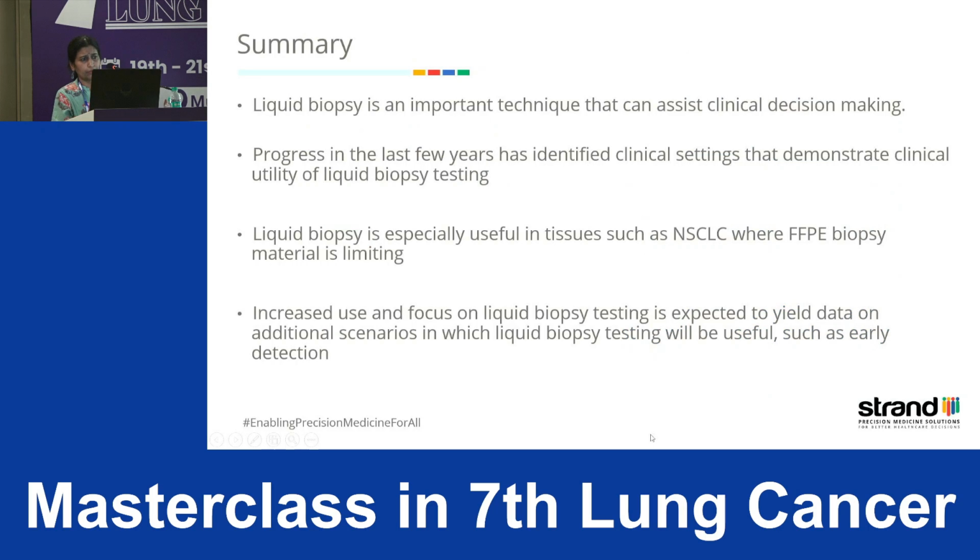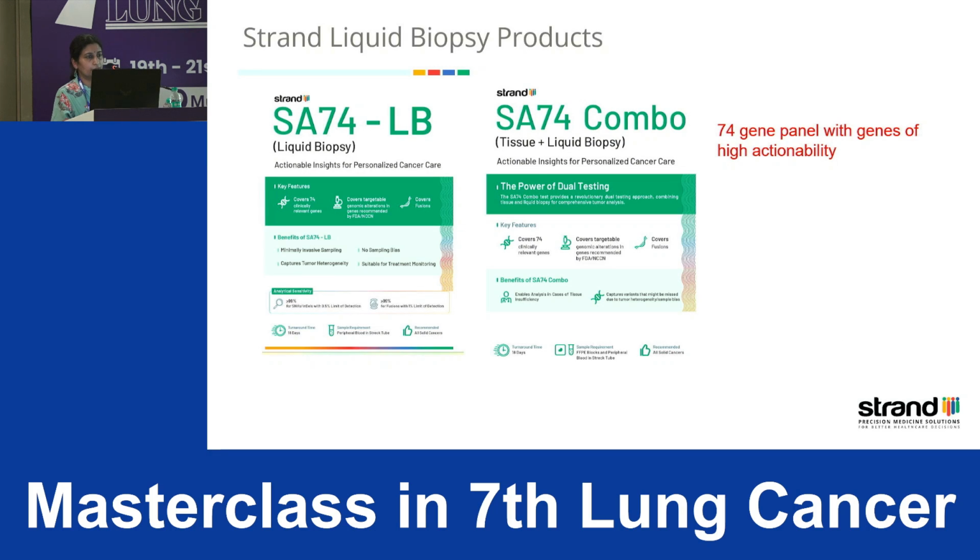So to summarize, liquid biopsy is an important technique that can aid in clinical decision making. Progress in the last few years has identified clinical settings that demonstrate clinical utility, and much work is of course needed. It's especially useful in tissues like NSCLC where FFPE biopsy material is limiting. Increased use and focus on liquid biopsy testing will yield additional data on additional scenarios in which it will be useful. So I'll just take the last 2 minutes to talk about our liquid biopsy product now.